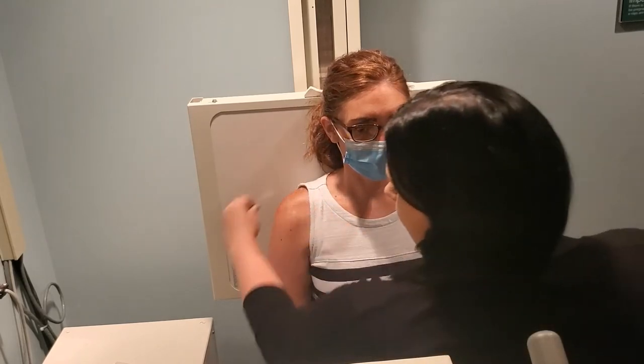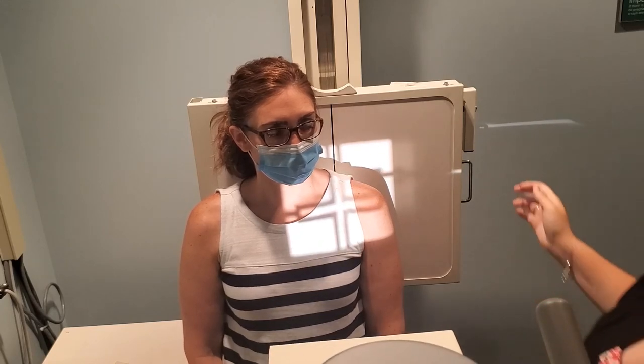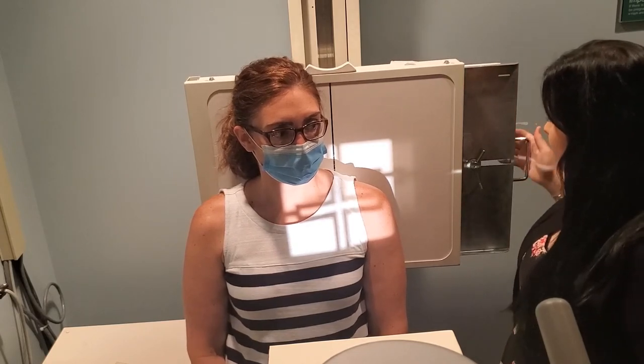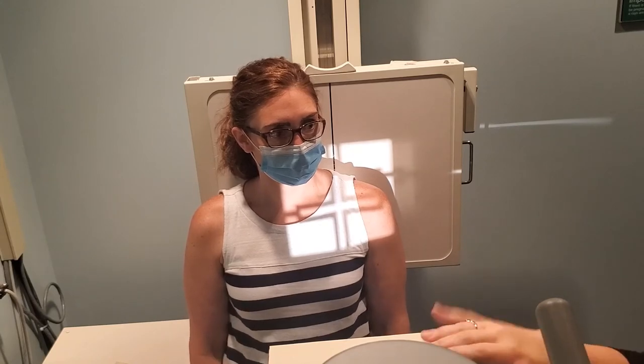The next image we're going to do is the AP oblique Grashey method. This image is in particular looking at the glenohumeral joint, so you're going to have the patient in a rotated position. The CR is going to be basically directly in that glenohumeral joint, so it's going to be up just a touch from your plain AP shoulder projection. Again, touch the tube, touch the bucky — make sure you're realigning every time you move one. I can't tell you how many times I failed competencies at clinical for moving one and not the other.